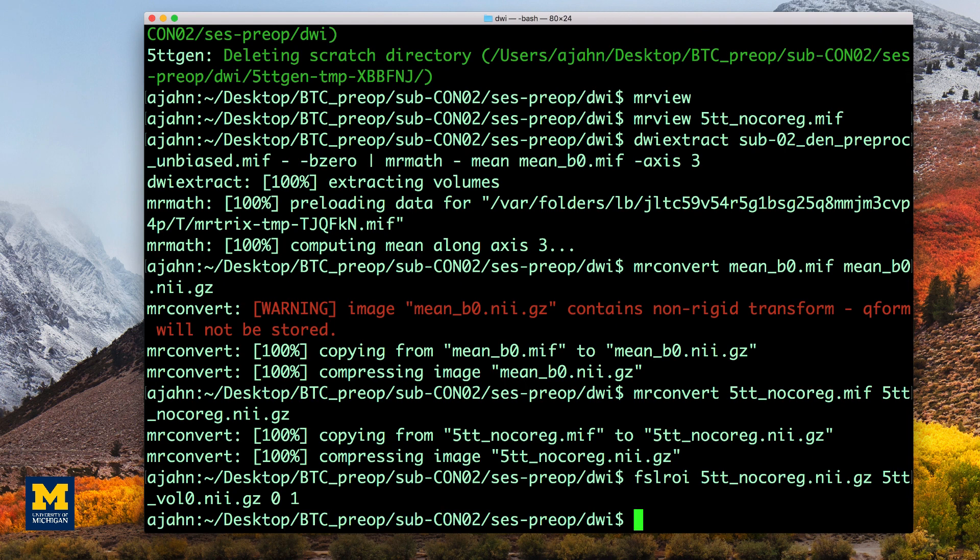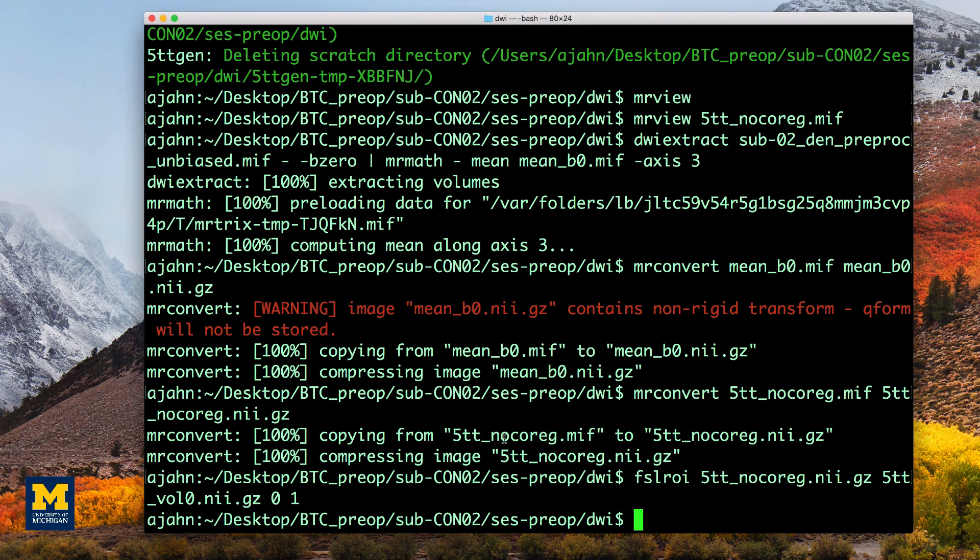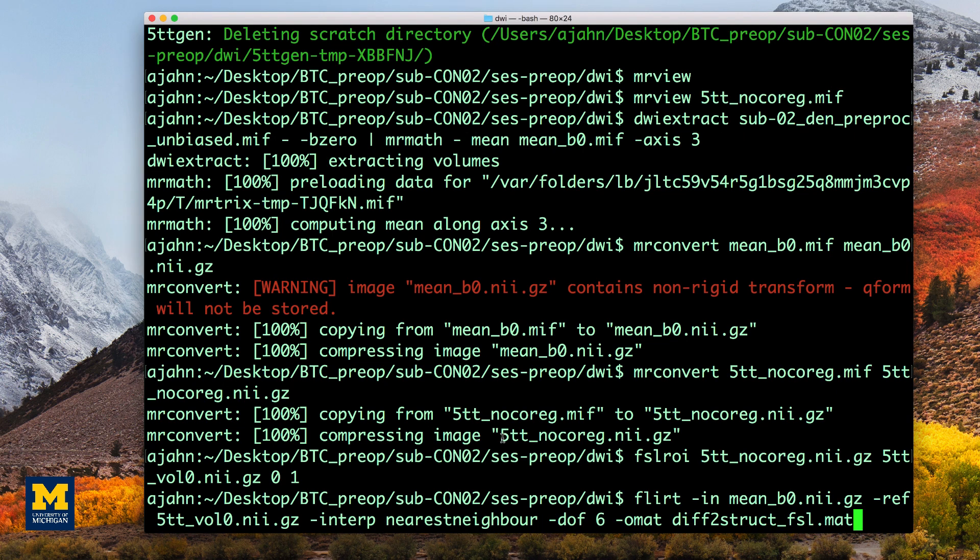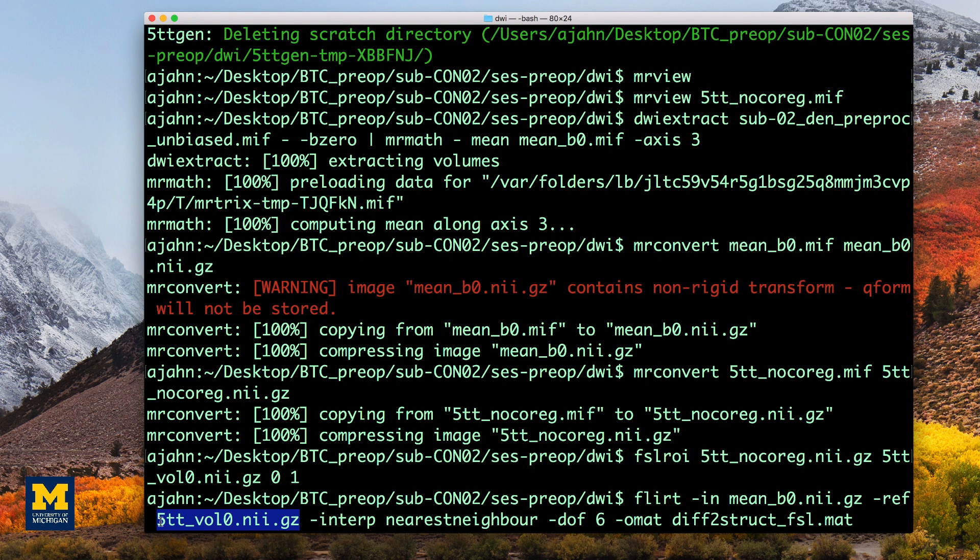We then use the FLIRT command to co-register the two datasets. This command uses the gray matter segmentation 5tt_vol0.nii as the reference image, meaning that it remains stationary. The averaged B0 images are then moved to find the best fit with the gray matter segmentation.